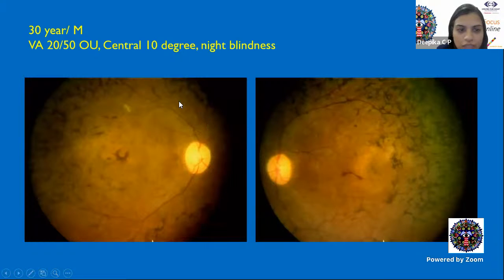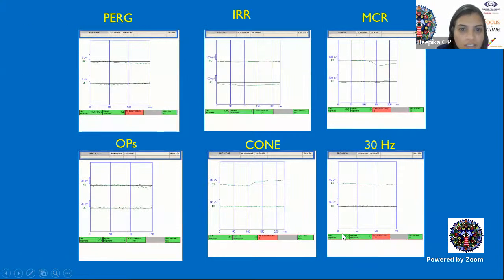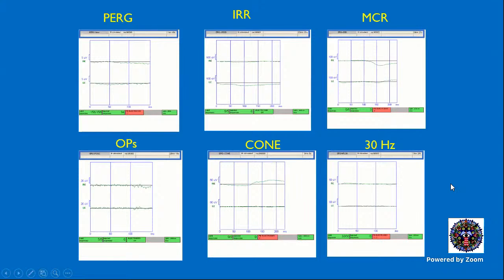A typical fundus photo of RP with peripheral bony spicules, macular involvement as well with pigments and atrophy. So this is the ERG. Let us see what the pattern ERG and also the full field responses show. If Dr. Soni can take up this question and try to answer what we are seeing here. Ma'am, both the scotopic and the light adapted phase show both rod and cone responses extinguished, and there are no oscillatory potentials also.